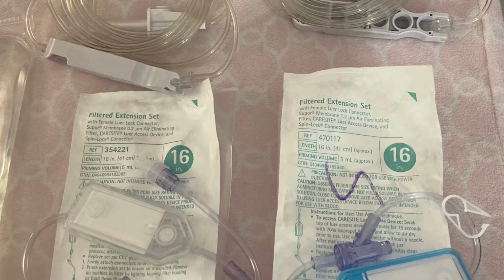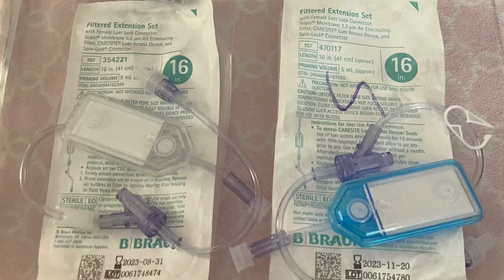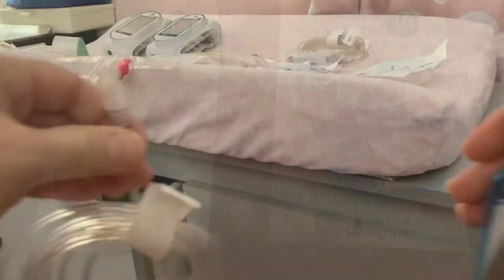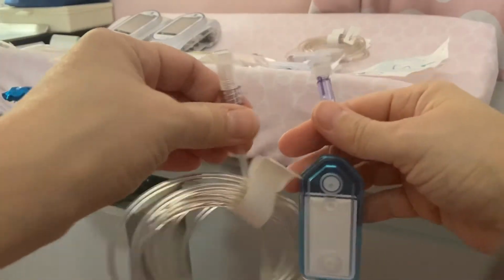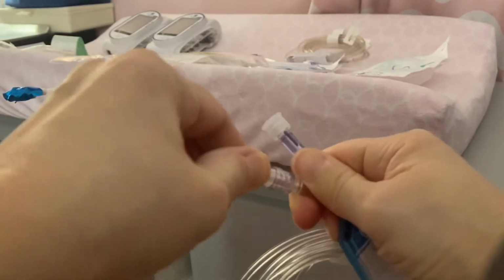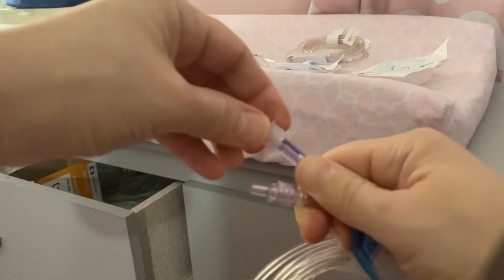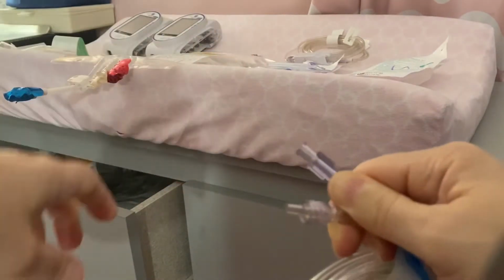You will see 1 filter has an S written on it. That is a blue filter and it has to be attached to the lipids bag. Take 1 filter and 1 tubing set. Put the 2 ends you will connect in one hand and remove the caps with the other hand. Be sure your fingers do not touch the open ends. If they do, it must be thrown out and you get a new one.